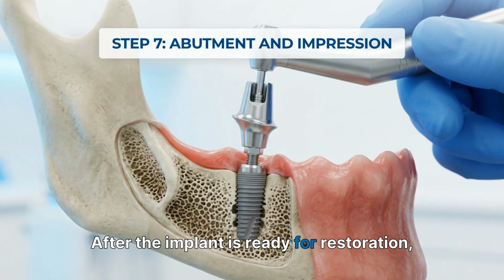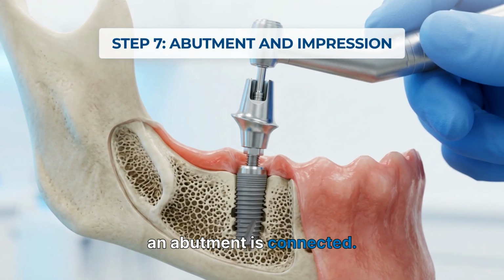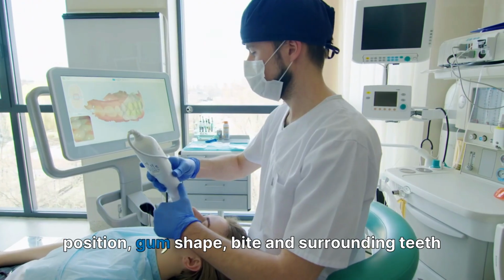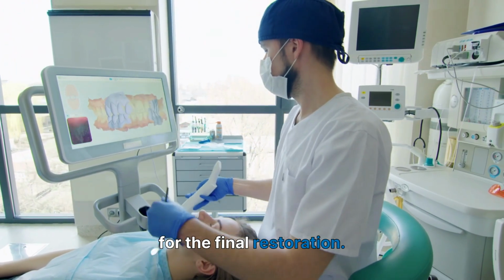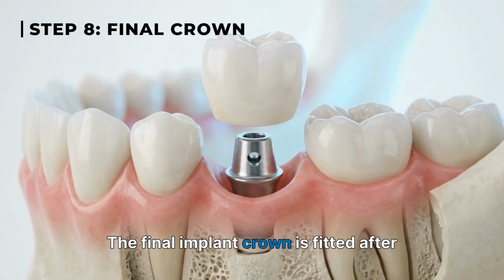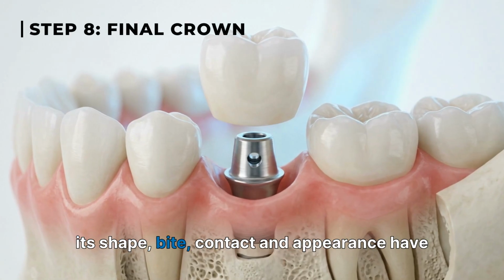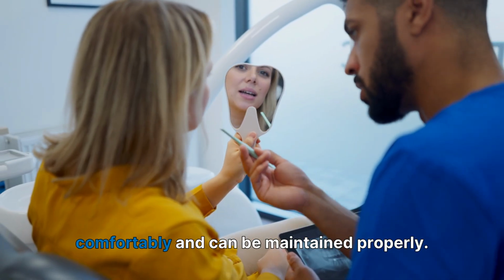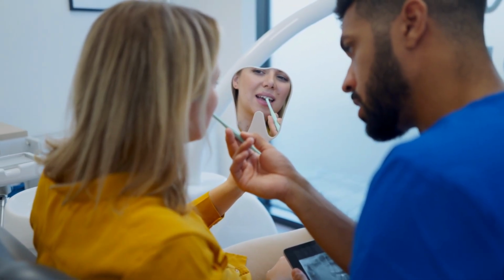After the implant is ready for restoration, an abutment is connected. A digital scan or impression records the position, gum shape, bite, and surrounding teeth for the final restoration. The final implant crown is fitted after its shape, bite, contact, and appearance have been checked. The goal is a restoration that functions comfortably and can be maintained properly.